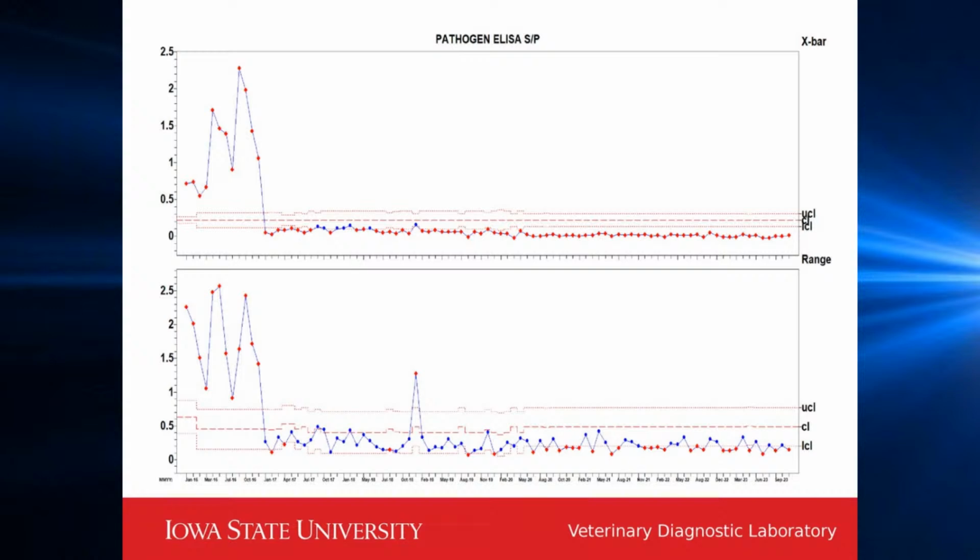So in this farm, first I want to show you what the thought pattern is in looking at these charts. We first begin by calculating the averages and the ranges within a sample set for the entire data set. And that explains why the data points for both of these graphs are either on one side or the other of the average, or they're just seemingly senseless because of the way that the limits were calculated for every sample set.